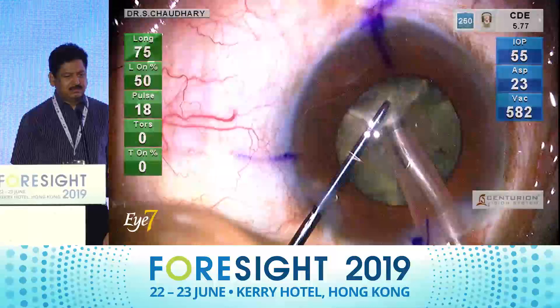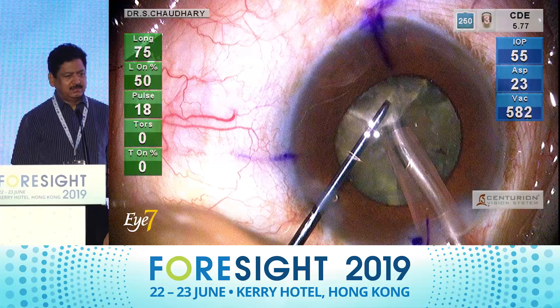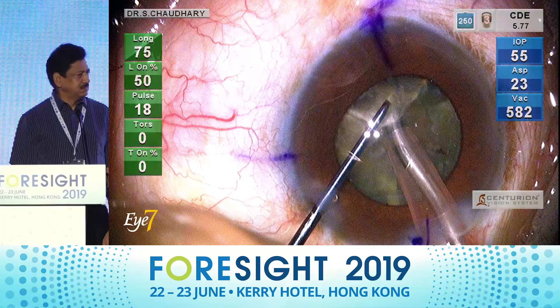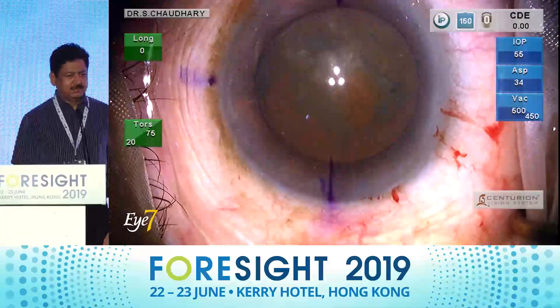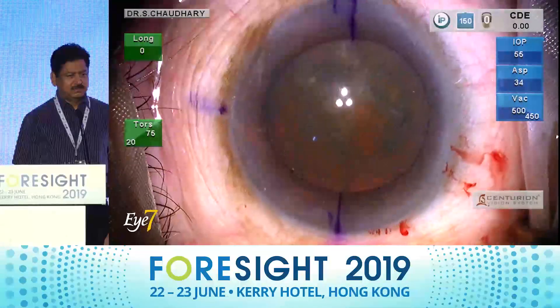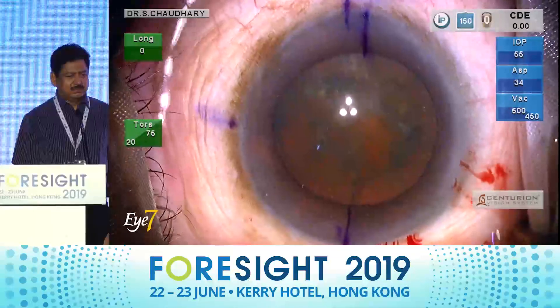These are my settings for the longitudinal phaco: longitudinal amplitude at 75, on-time at 50%, pulse at 18, zero torsional.